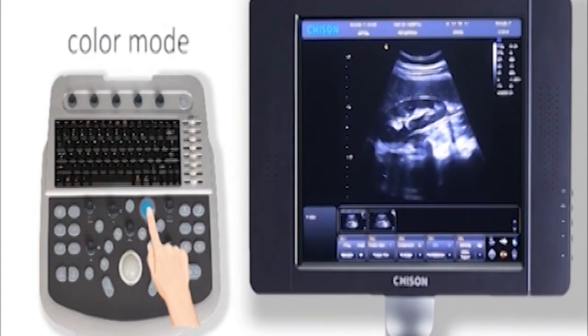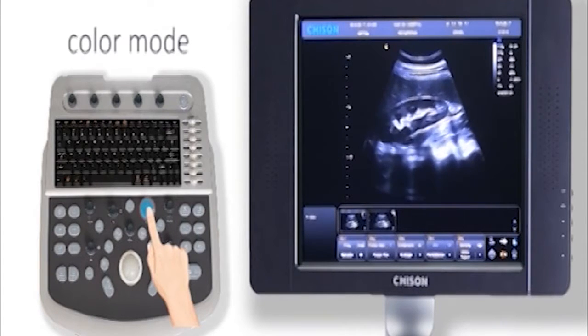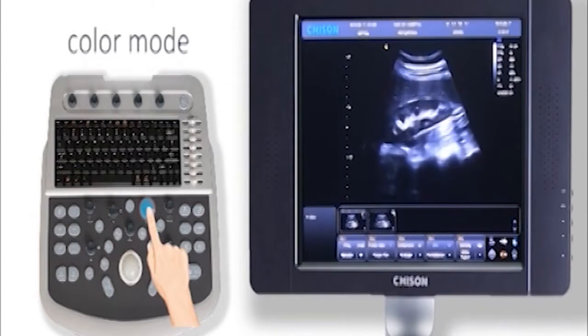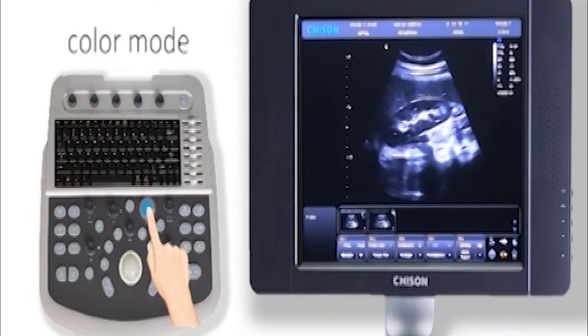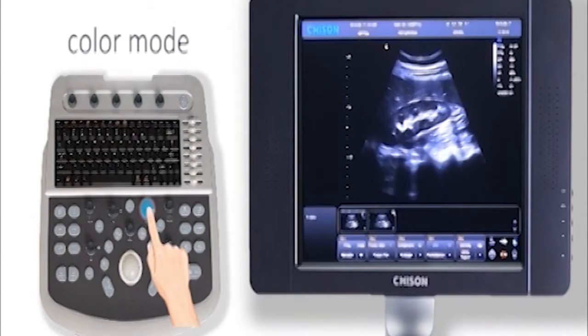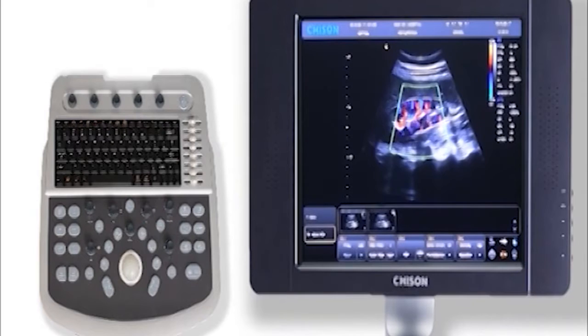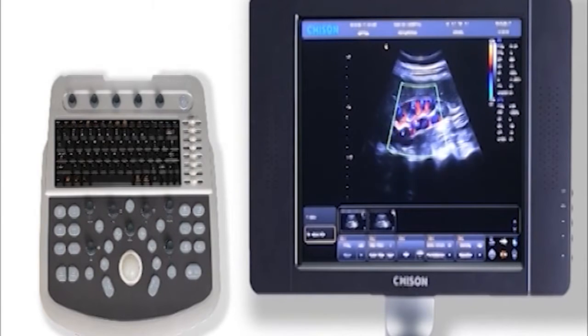Let's move to color mode. In color mode, we need to adjust four basic parameters: interest box, color gain, PRF, and wall filter.